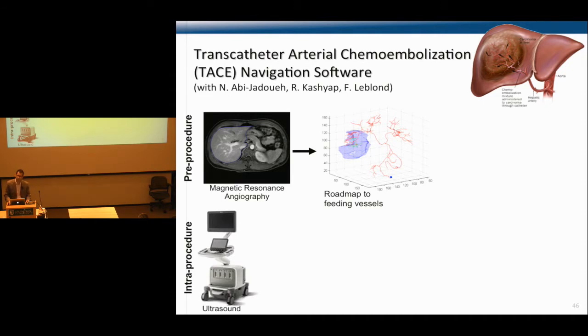With regards to the prostate, the MR variants are getting pretty good at identifying where suspicious lesions are. Do you think they'll ever get to the point where we won't need to use the biopsy anymore? What is the rationale you see for still taking the biopsy if we're guiding it with the MR? Well, I think they still need to confirm that with histopathology, taking tissue from the prostate and confirming with pathology that they have cancerous cells.